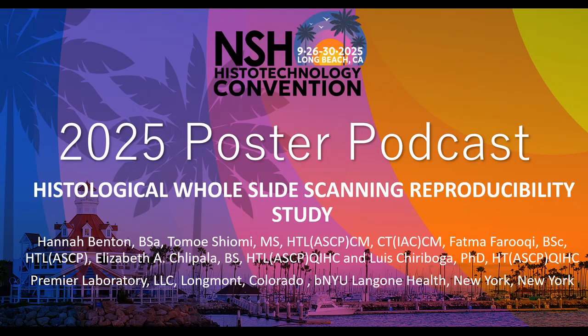And we had to think about that a little bit. But it kind of somewhat makes sense, and it kind of somewhat makes sense in some of the other publications that we've done on H&E staining reproducibility over the years. Yeah. So we've seen that, and you'll see it more impactful on eosin-rich tissues, and then hematoxylin-rich tissues.